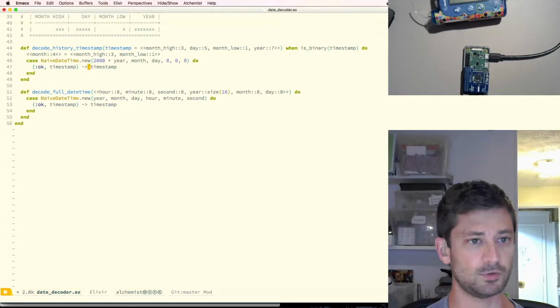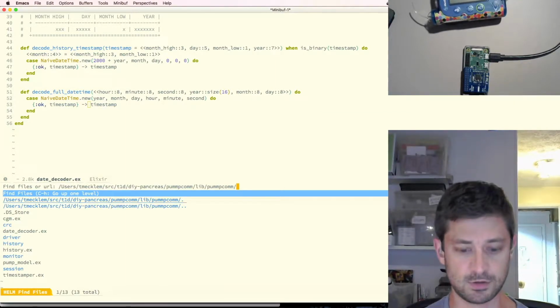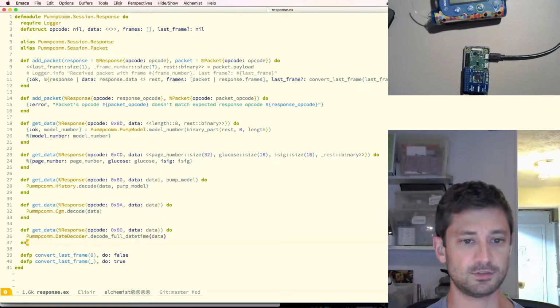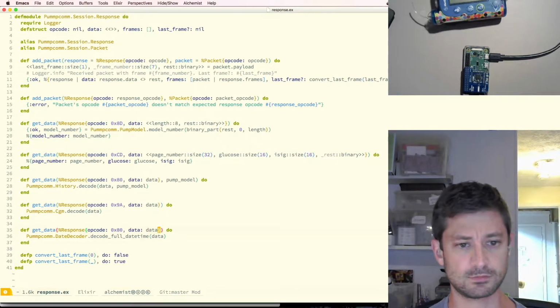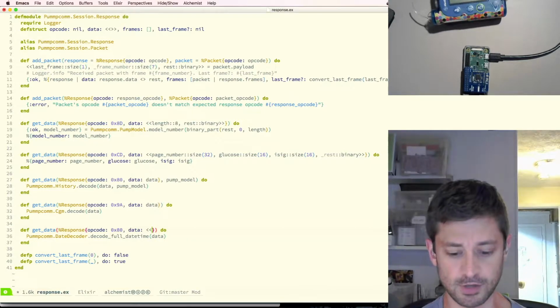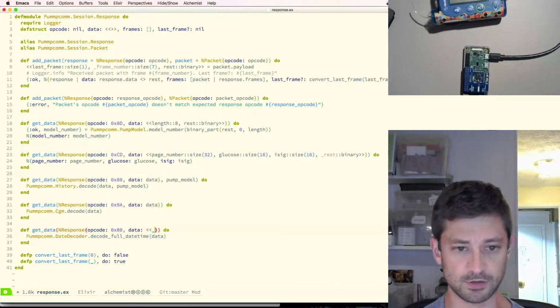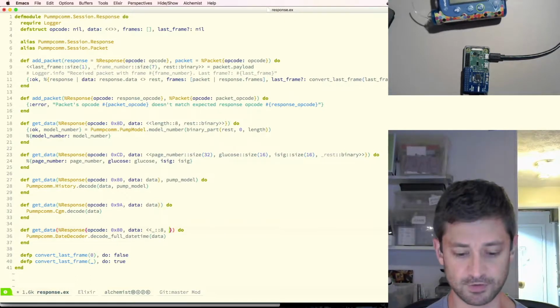I'm not sure why I'm just wrapping this thing in a... Okay, I'll have to come back and look at that later. So now if I go back into the response, this is actually the place where I should have done that binary decoding. So the first byte means something, but I don't know what it is. And then the next 7 bytes after that are the date.